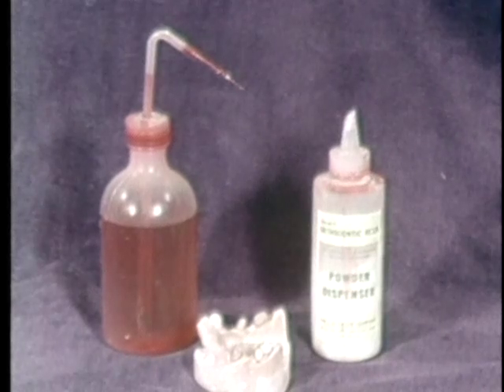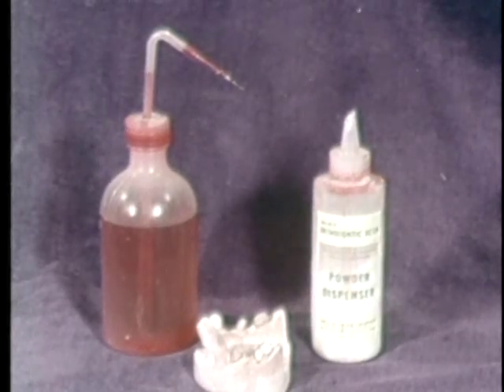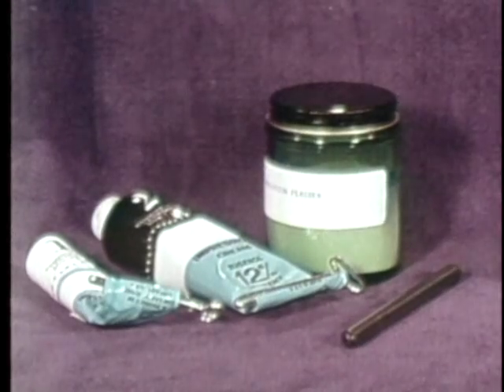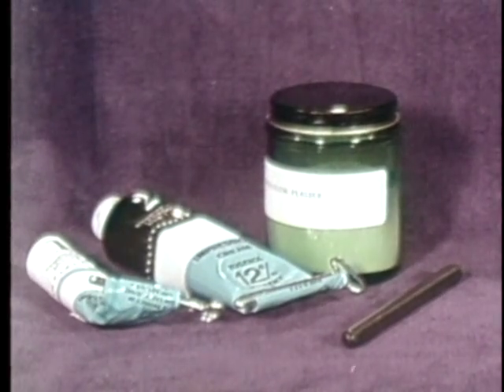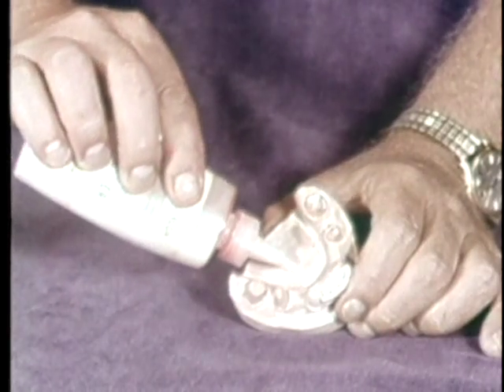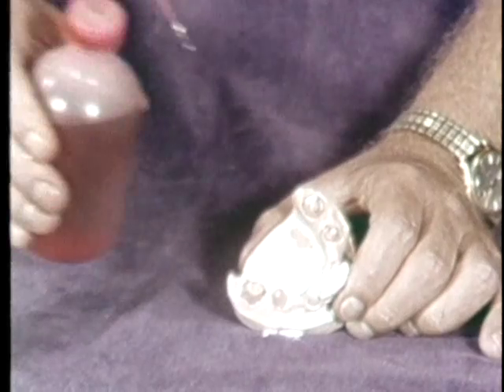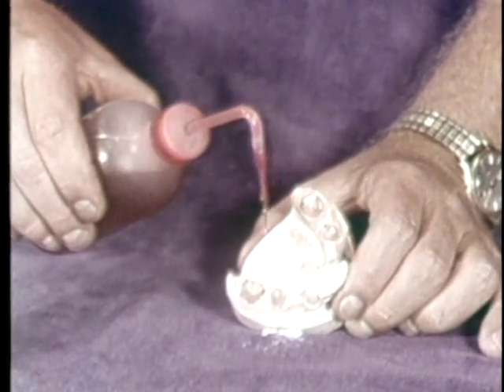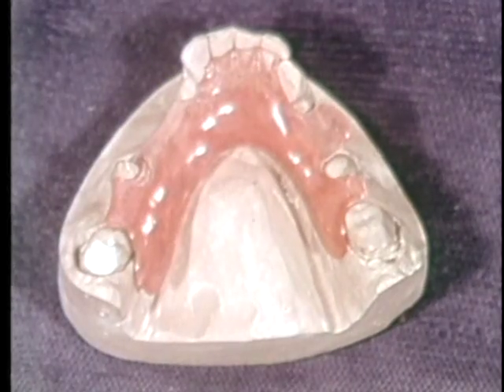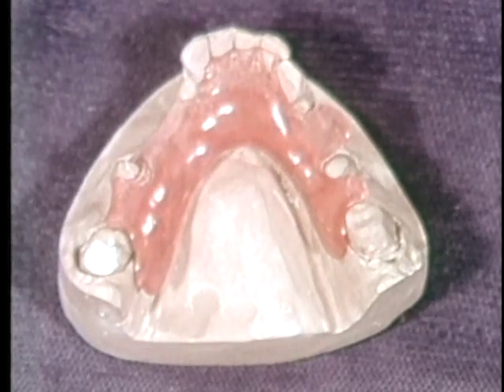If there is an insufficient number of teeth in the mouth for positive stops, it is suggested that auto-polymerizing resin serve as the material for the record base. The recording material can be zinc oxide eugenol paste, plaster, or modeling plastic. The situation shown here on casts makes use of the sprinkle-on resin method. This technique is preferable to resin molded or adapted to the cast, as the base has better stability and distortion is reduced.